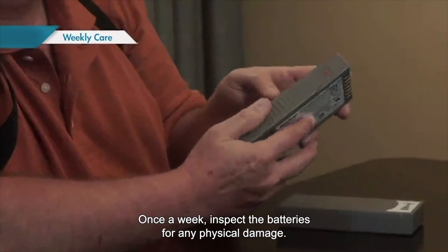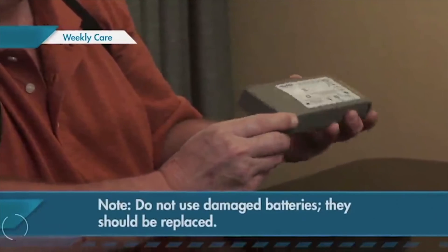Once a week, inspect the batteries for any physical damage. Do not use damaged batteries — they should be replaced.